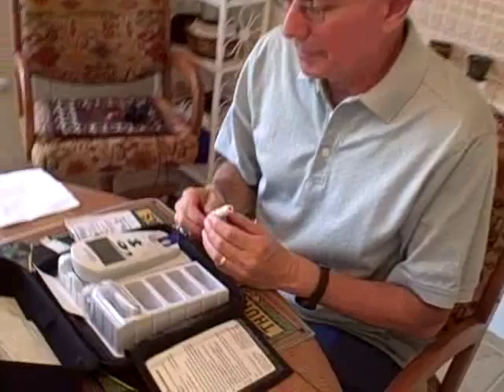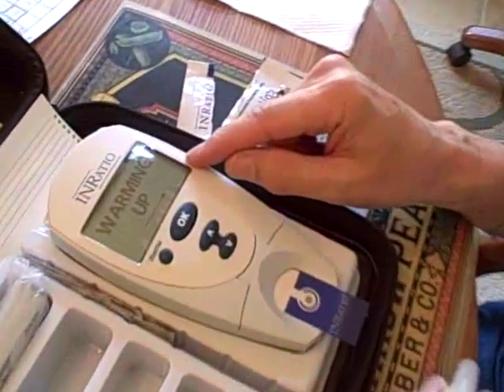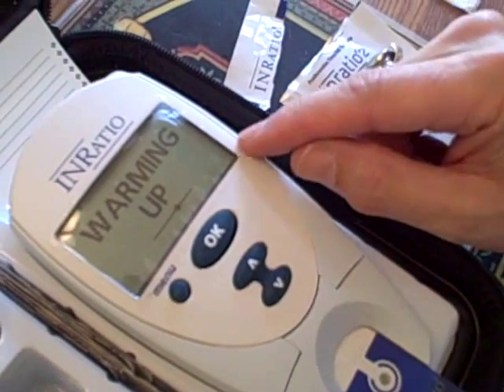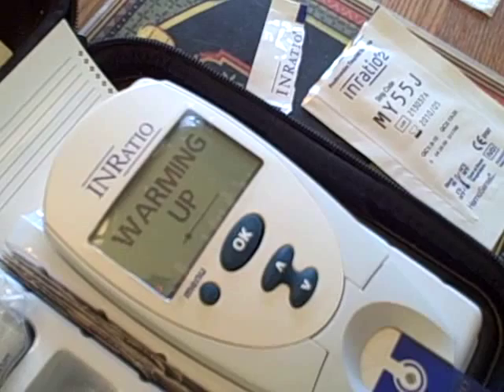He's started. It's warming up, which doesn't take too long.